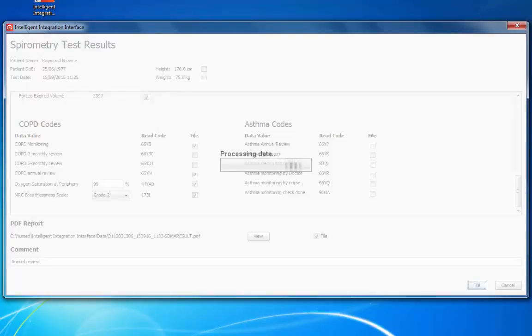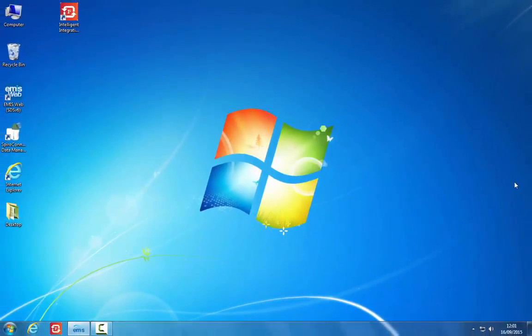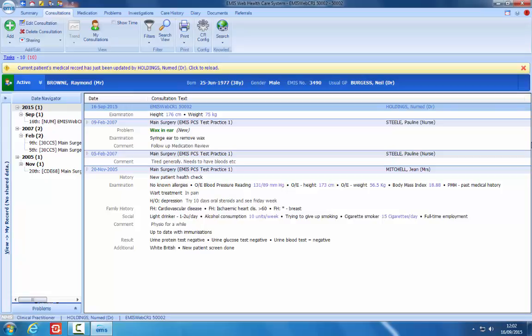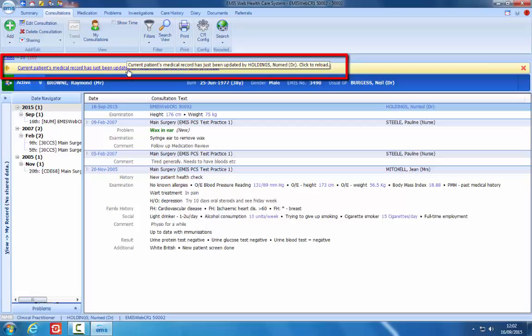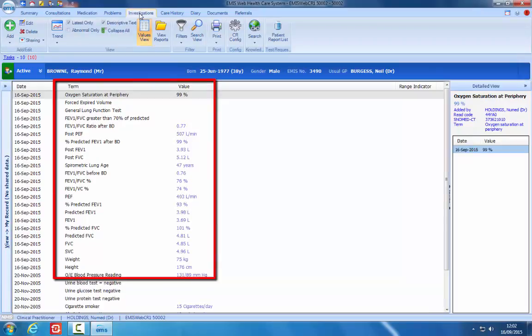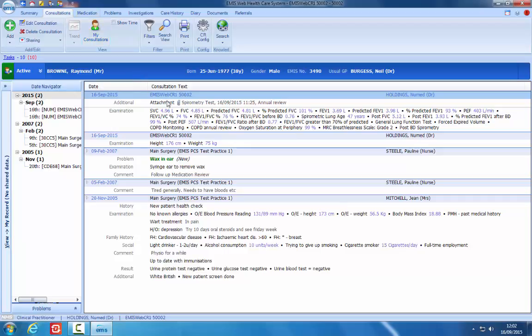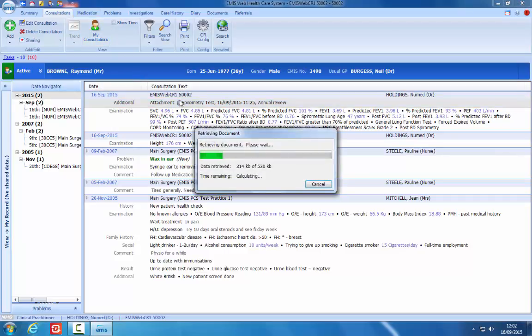The data may take a few seconds to file depending on the number of values being transferred and the speed of the connection. A confirmation message will be shown when the data has filed successfully. The results can now be viewed in the patient record. If a consultation was open, you may need to refresh the data by clicking on the information bar. The data values will be shown in the consultation and can also be seen in the Investigations tab. Double-clicking the attachment paperclip in Consultations view will open the PDF report of the spirometry test.